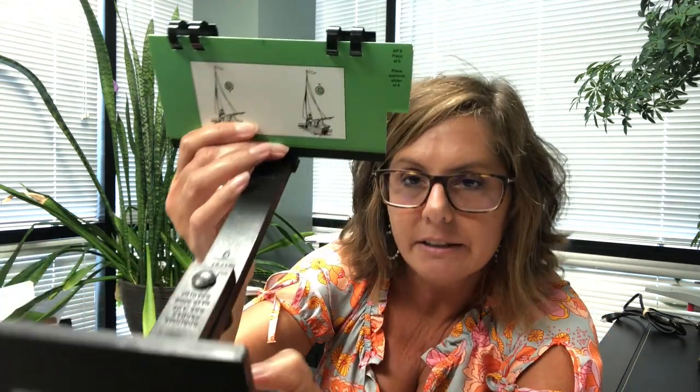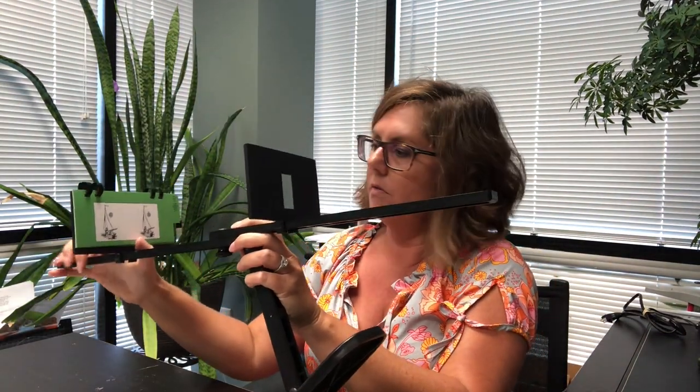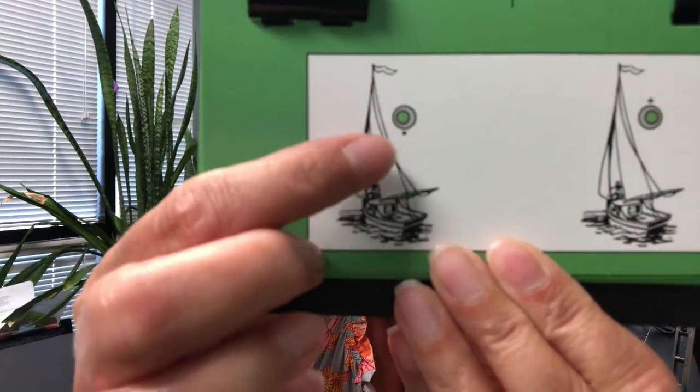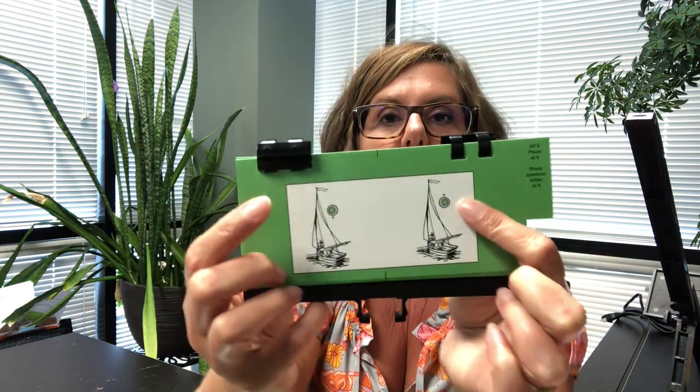We might need to start you off with an easier card. I jumped into the hard one right away — you can see there are two sailboats. Let me show you a little bit better what this card looks like with the little circle. You can see here that one circle has a dot and the other has a plus. When your eyes visually put this together you get one combined image, with the little plus above the circle and the little dot below. There's an outer circle and an inner circle that will either pop out if you're crossing your eyes or go away from you if you are diverging or relaxing your eyes.